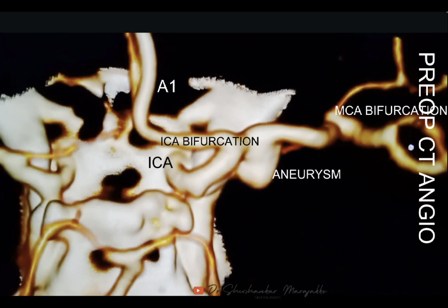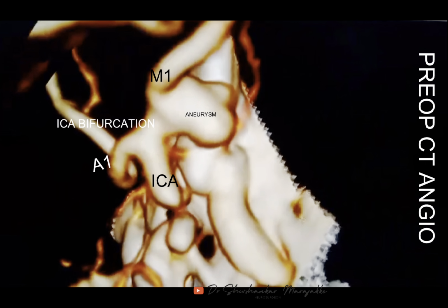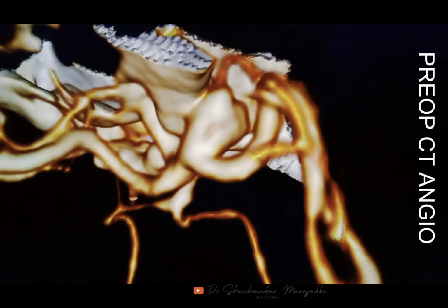In this 3D reconstruction image, you can see this is the ICA bifurcation. Immediately after the bifurcation, after M1, the aneurysm is arising. It is quite large, the neck is wide, and you can see here the anterior temporal artery. It is seen arising from here. This is a beautiful anatomy: A1, M1, MCA, ICA, everything. So this is the aneurysm, that is ICA, this is M1, this is the ICA bifurcation. And you can see the anterior temporal artery arising at the neck of the aneurysm here. So this is the anatomy.